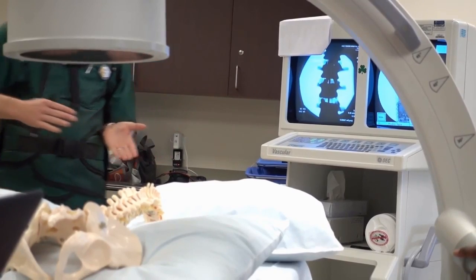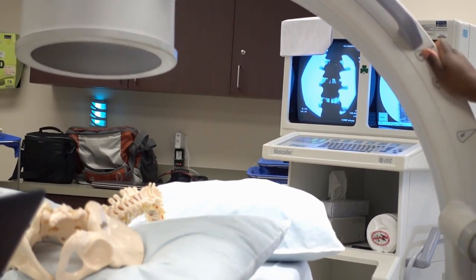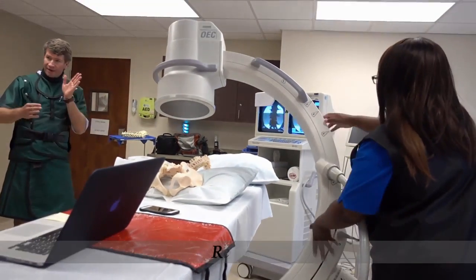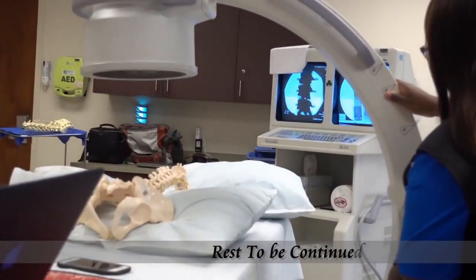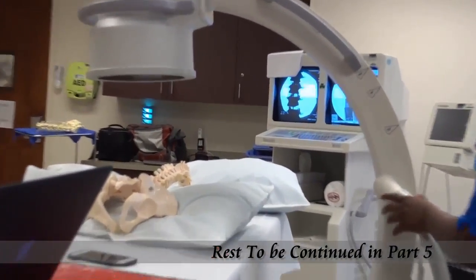Maybe even try going a little extra, a little too much, and just see what happens. It may make it better, it may not. Nope, it didn't. So we're trying to find that perfect spot where the disc is crisp, okay? And you can see it on this projection here.